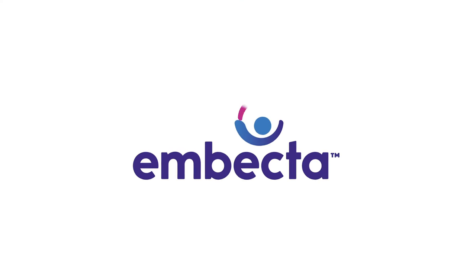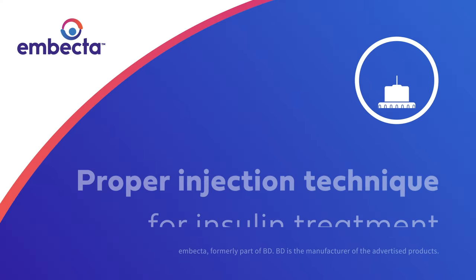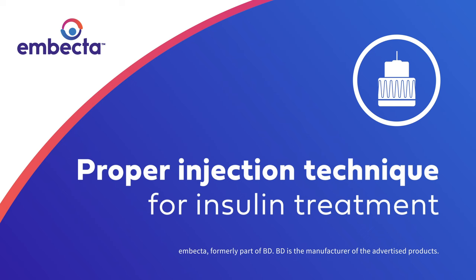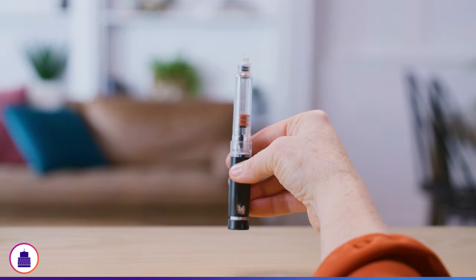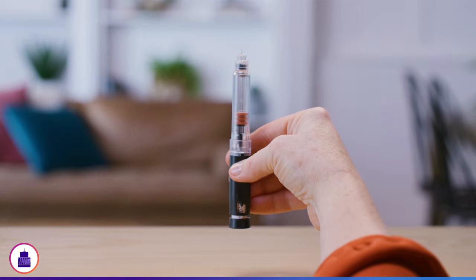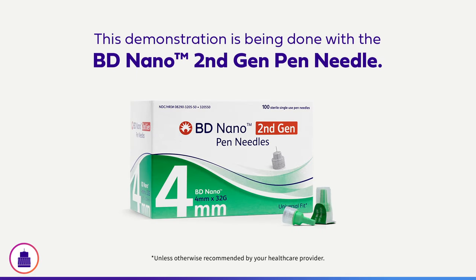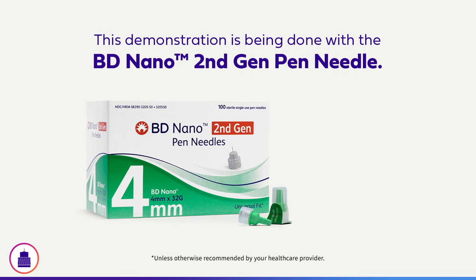Injecting insulin to manage your diabetes? Did you know that injecting insulin correctly is important to receive the full benefits of the medication? Today, we are going to cover the basics of how to inject insulin with a pen and pen needle. For today's demonstration, we will be using a 4mm contoured base pen needle, which is the needle length recommended for people injecting insulin.